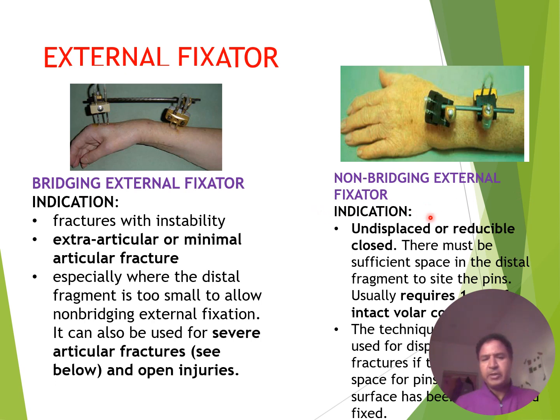Non-bridging external fixator indication: undisplaced or reducible closed fractures. There must be sufficient space in the distal fragment for the pins. Usually requires intact volar cortex, a technique used for displaced fractures.